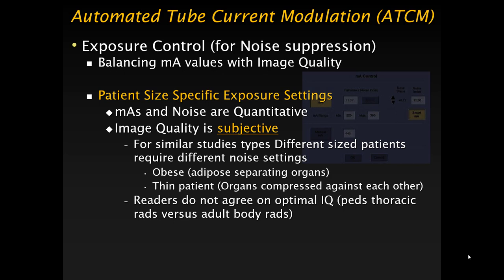And also there are the reader's biases where readers don't agree on what an optimal image quality is. Think about a peds thoracic radiologist versus an adult body radiologist, where they just wouldn't see eye to eye on what an acceptable image quality is going to be.